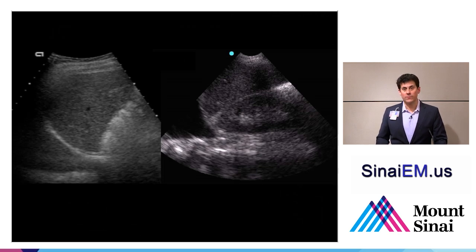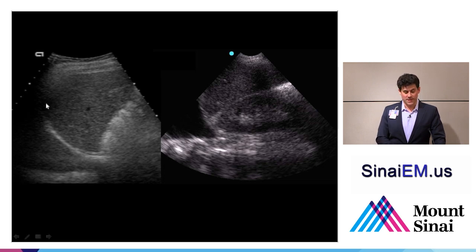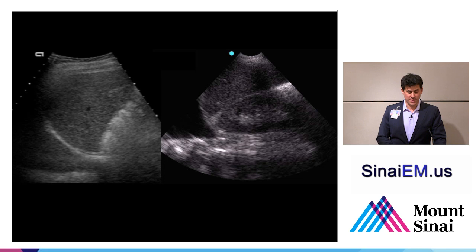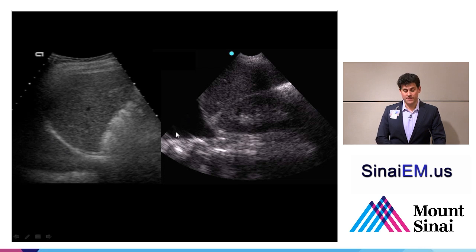While we're in this right upper quadrant view, we can also take a look a little bit higher, looking above the diaphragm. On the left-hand side here, we see the liver and the diaphragm, and looking above the diaphragm we see a mirror image artifact — a reflection of liver tissue appearing to extend into the thorax. This isn't actually liver tissue in the thorax, but just a reflection. This mirror image artifact is normal and what you'd expect to see in most patients. When we lose that mirror image artifact, it's actually a sign of hemothorax, pleural effusion, or some other fluid collection in the thorax.